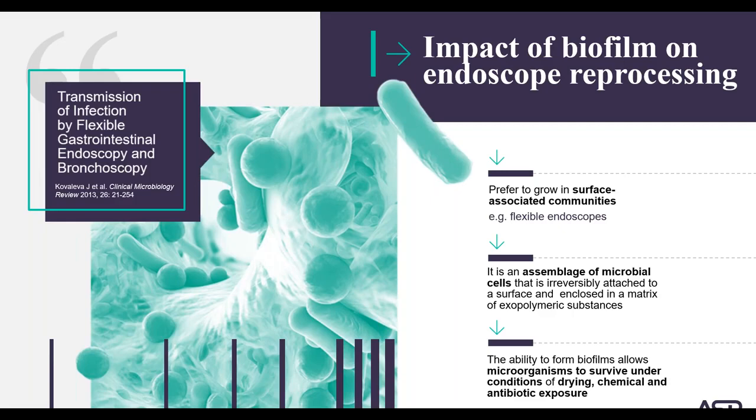When microorganisms form biofilms, they can survive under conditions of drying, chemical exposure, and antibiotic exposure. The best way to deal with biofilm is to prevent it from occurring, and this can be accomplished by proper reprocessing and maintenance of the flexible scopes.